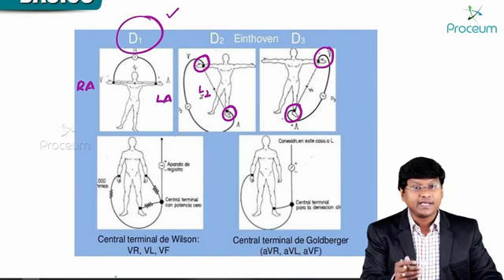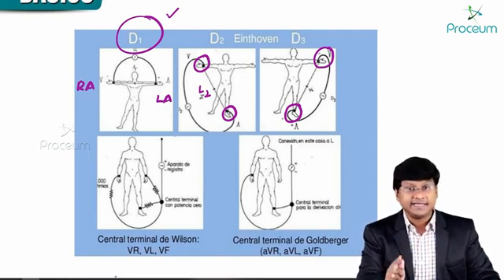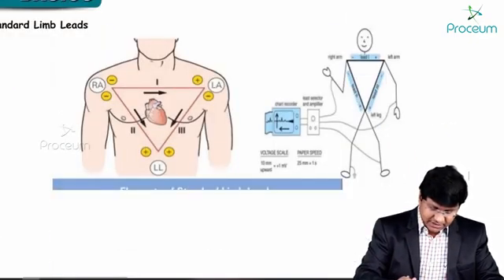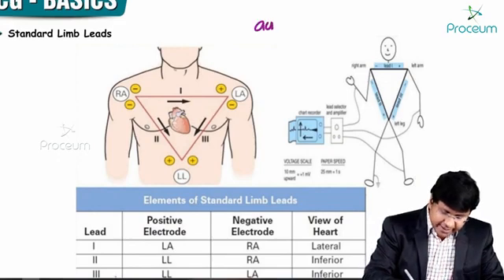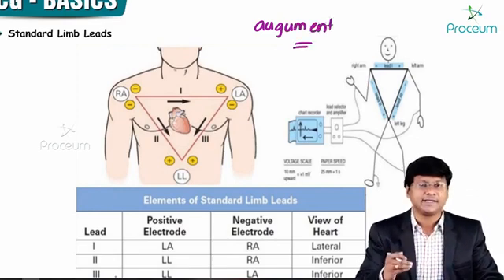Whereas you take AVR, AVL, AVF, right, that is augmented leads. Augmented leads, they are unipolar leads. Let me show you that. The word itself tells you: augmented leads mean they will just only augment.